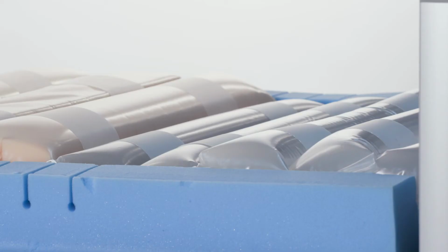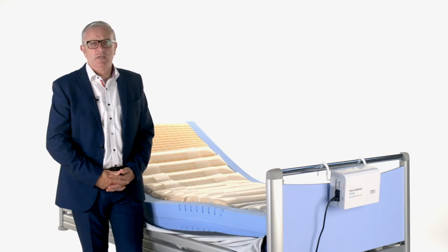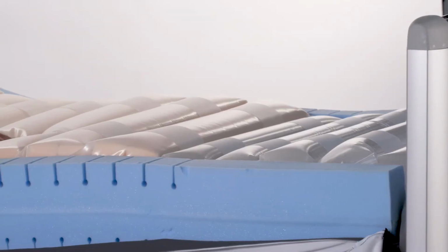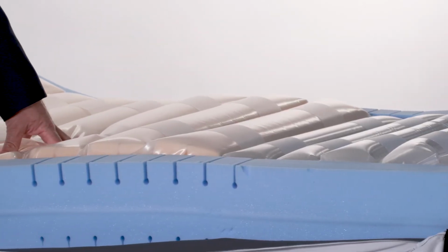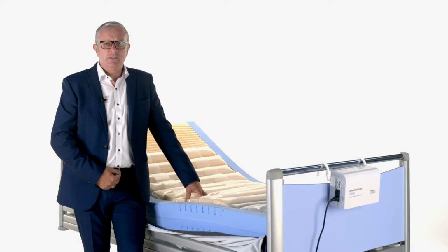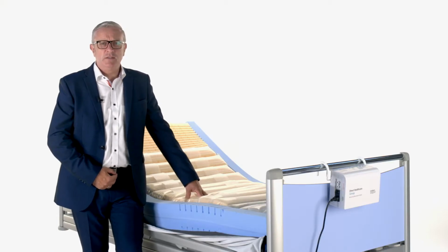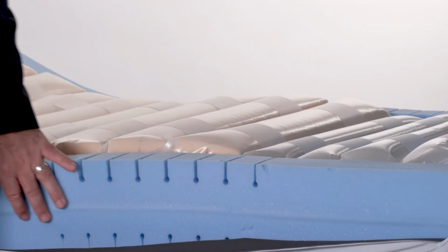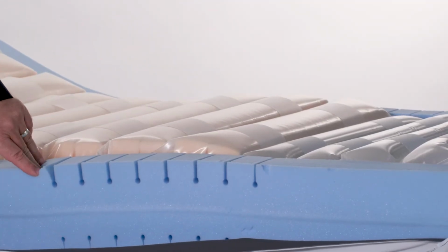During shipment, the heel cells may become deflated. To inflate these prior to clinical use, simply manipulate the main body cells in order to provide air to the heel zone cells, or briefly inflate the mattress with the pump. To zip the mattress back up, simply locate the zip alongside the side of the mattress and return it to the closed position in the lower left-hand corner of the mattress.